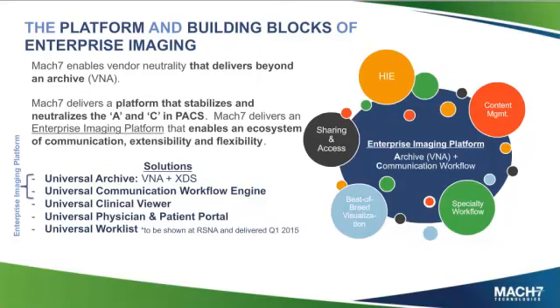And then thirdly, there are many viewers out there that I think more and more we're starting to see in the market can really go cacheless on top of your VNA. So truly in that decomposition of a PACS, you can buy just a visualization tool that has optimized either over a standards protocol or even doing direct storage mapping. It can get direct access to the data that is managed by the VNA, and so literally have a full-fledged thin client to zero footprint diagnostic viewer that does both 2D, 3D, MIP, MPR without having a single cache or storage on their servers. So I think we're starting to see more and more of those hit the market.